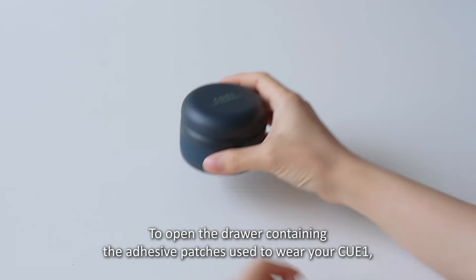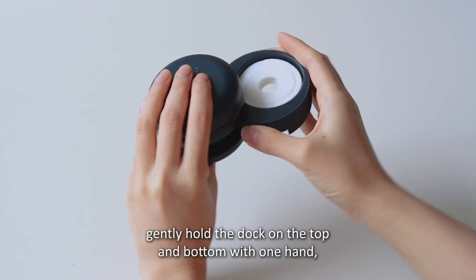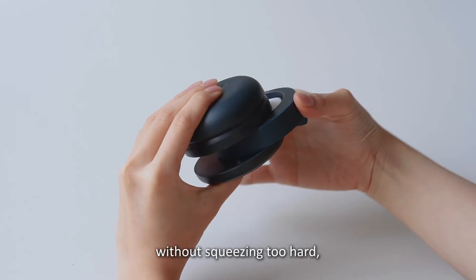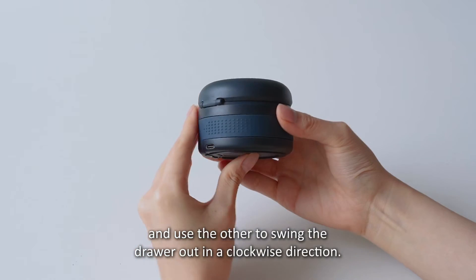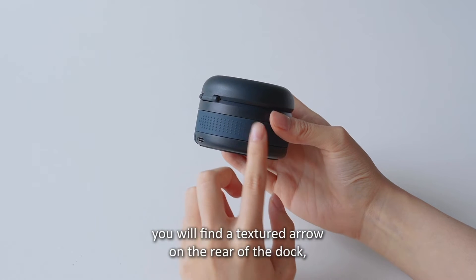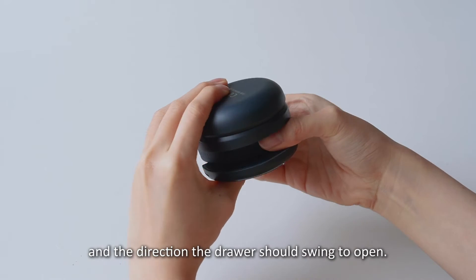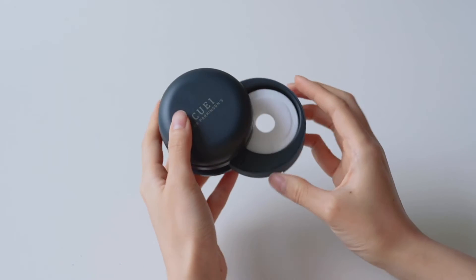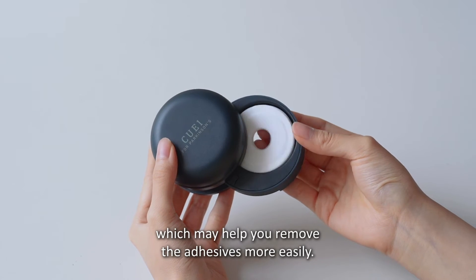To open the drawer containing the adhesive patches used to wear your Q1, gently hold the dock on the top and bottom with one hand without squeezing too hard, and use the other to swing the drawer out in a clockwise direction. You will find a textured arrow on the rear of the dock, indicating the best placement for your finger and the direction the drawer should swing open. There is a hole in the bottom of the drawer which may help you remove the adhesives more easily.